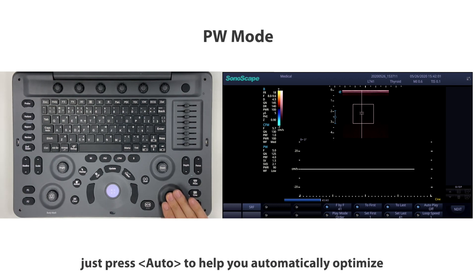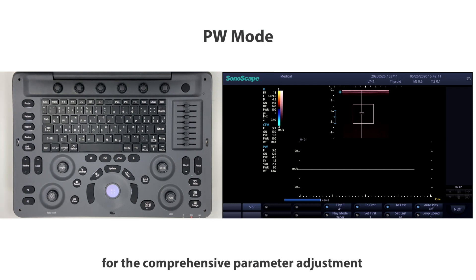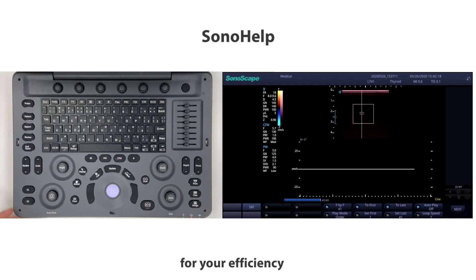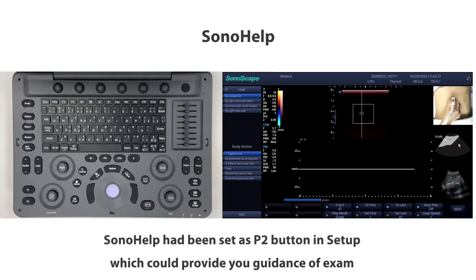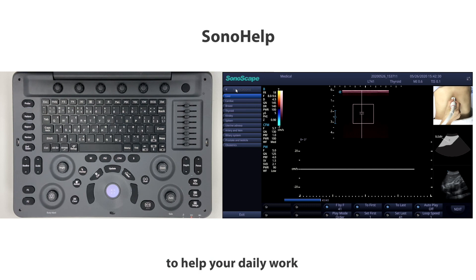Don't forget to freeze after you get the PW image you want. If you want to optimize your image more easily, press Auto to automatically optimize B, color, and PW mode — it saves time for comprehensive parameter adjustment. The E-series is also equipped with practical functions such as Sona Help, which provides guidance for the exam, along with other valued function buttons on the keyboard.